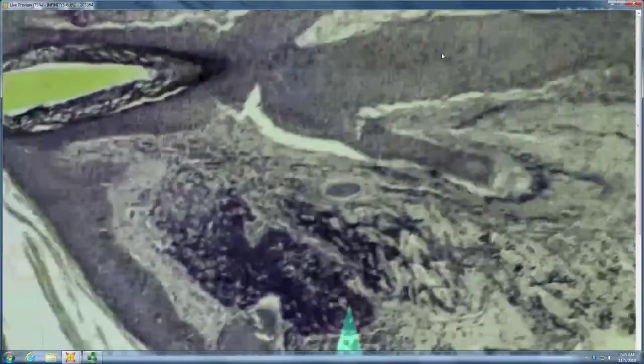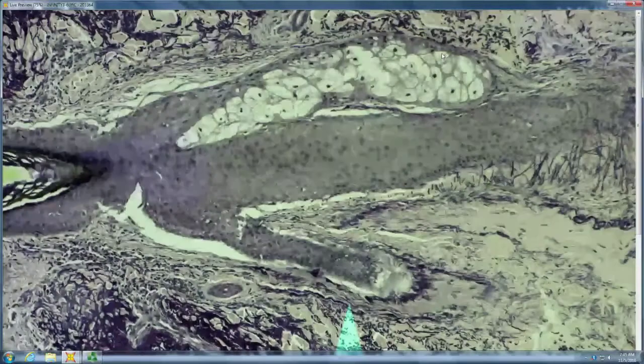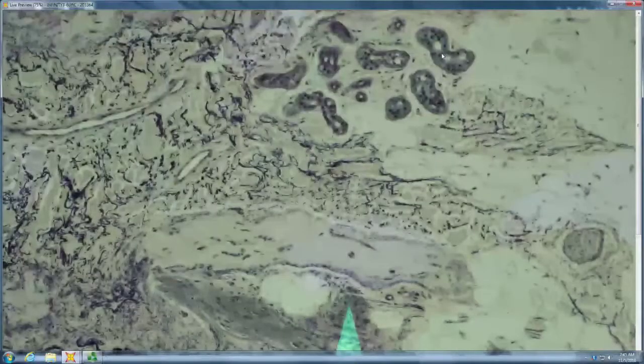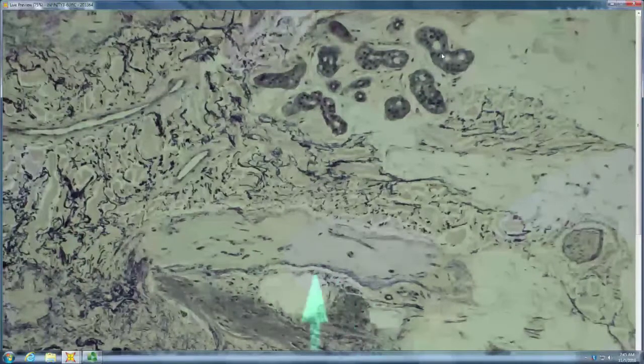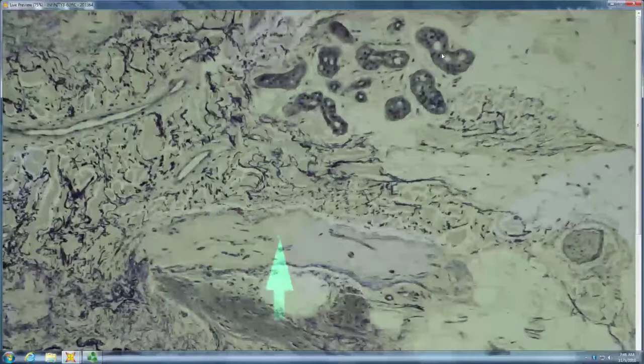It also shows you what normal fibrous tract remnants look like. So where the hair used to be, there's a perfect one right in the middle. So this is the empty sock without the foot, right? You still see the elastic sheath on the outside, and the foot was pulled out of the sock, but the sock's still sitting there, right?